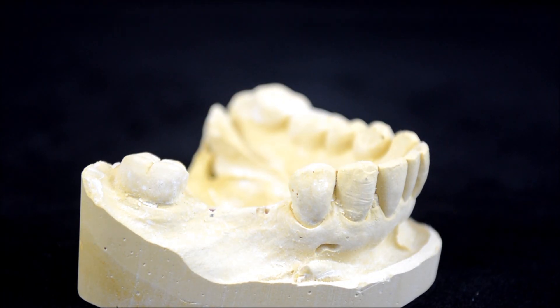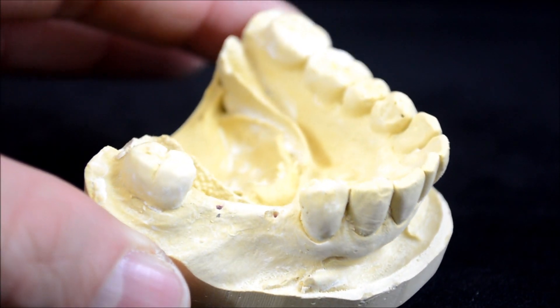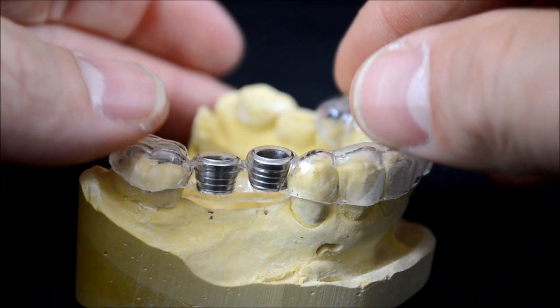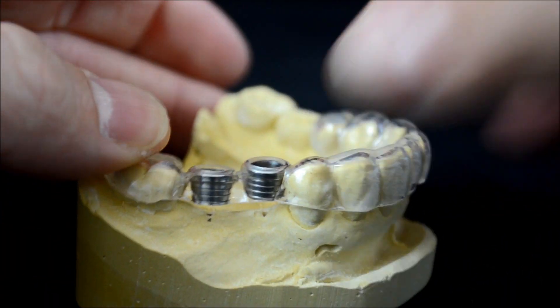This video illustrates the basic drilling protocol using the thin layer drill guide system from Guided Surgery Solutions. Here we have a patient who is to receive implants in the 29 and 30 positions.